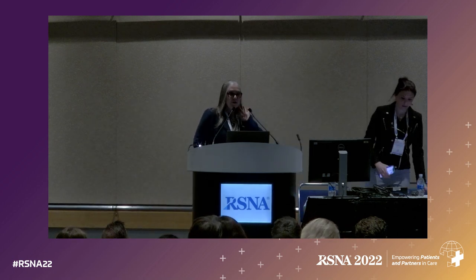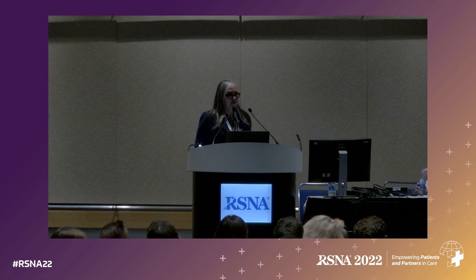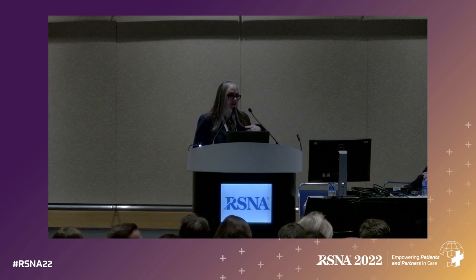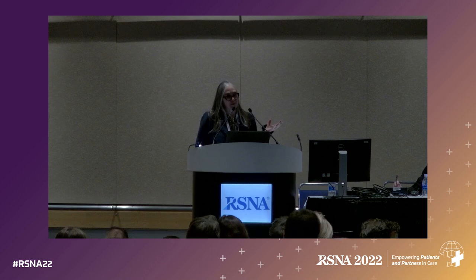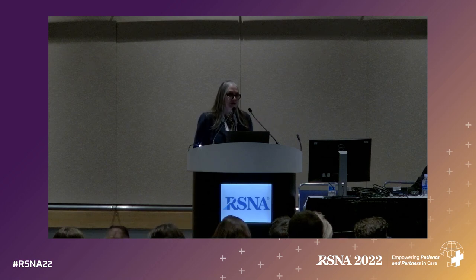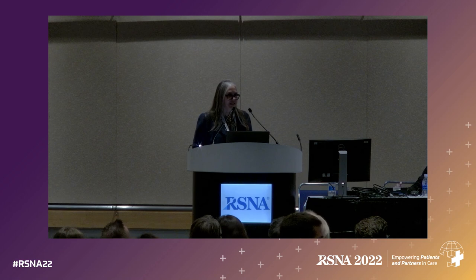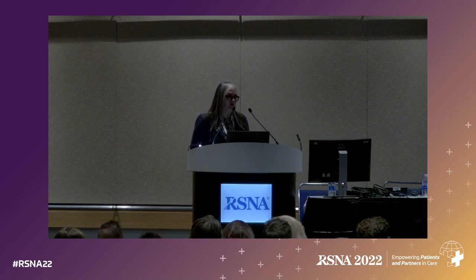Thanks for that question. So it depends on the proximity of the ulcer, if there is an ulcer. And if an ulcer probes to bone and we see T2 hyperintensity but no T1 hypointensity, we just wait a minute until that shows up. But if we do not have an ulcer probing to bone and we do see only T2 hyperintensity, we do couch our description with reactive osteitis versus early osteomyelitis, just like the Penn State people did in their paper, and we have a conversation with the surgeons and the medical team to decide how to manage this patient, because not all cases are obvious by any means.